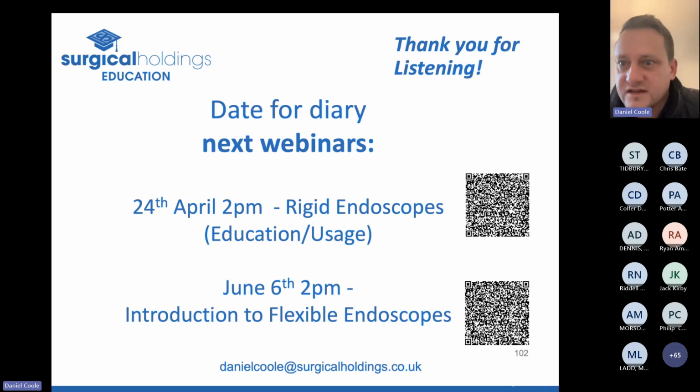So, question for Solicity. No problem. Thanks. Very happy to do the presentation for everyone. When you carry out refurbishment of instruments, do you check the quality of steel and protein level? Does it come under the scope of remanufacturing or adding? So there's a couple of different questions in there. So the first one, do we check the quality of steel? The only way we actually do that, we repassivate all the instruments, and that is our way of testing the steel.